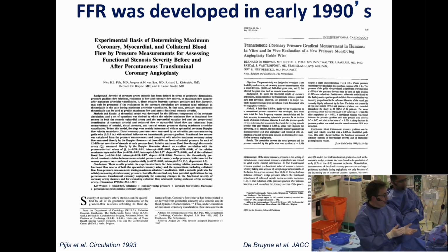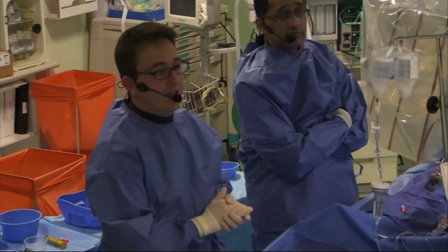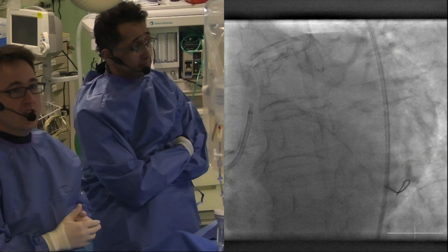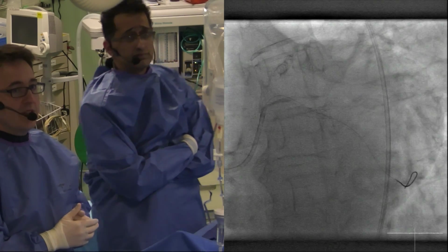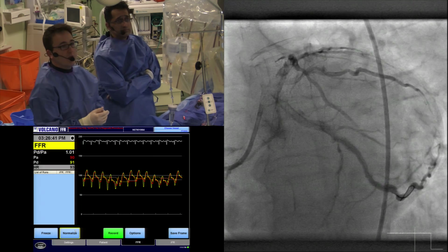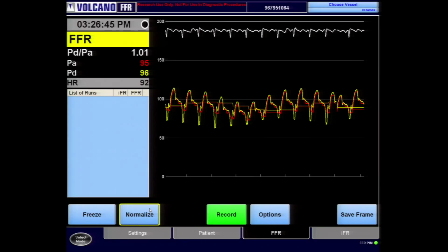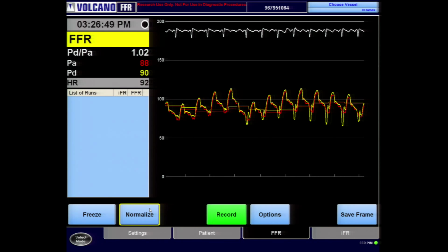So that's great. So Iqbal, in that time you've managed to get the wire down there. And if we can see the physiology traces on the screen, this may give us some information about what's actually going on, and perhaps you've got a situation here whereby the wire is just up against a little part of... there we go, look at that. So what did you do there to make the difference?